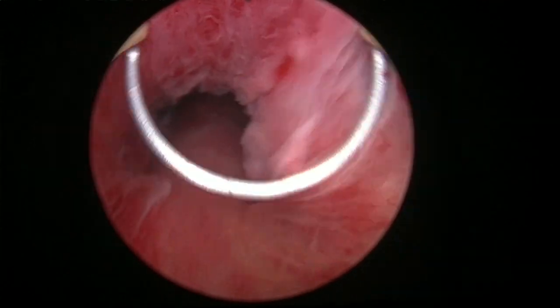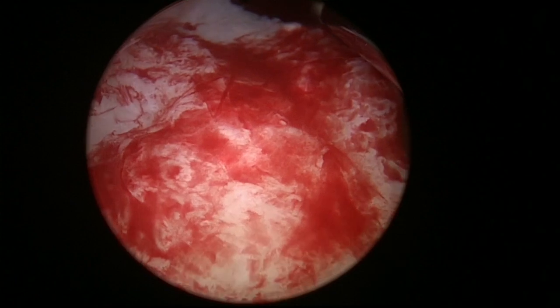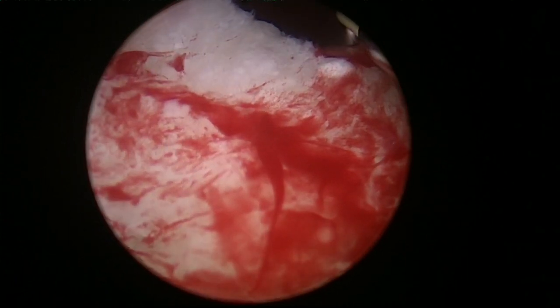You see, we managed to preserve the mucosa on the sphincter. There's a little bit of damage, I think, going in, probably because of this Cobb's collar. But you see, there's a small clot forming. But there doesn't seem to be any residual. Oh, yeah, there is. So there's a small piece. I'm going to try to... it's not well connected.